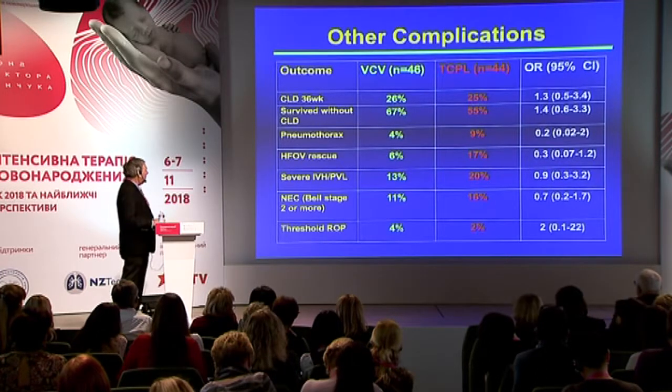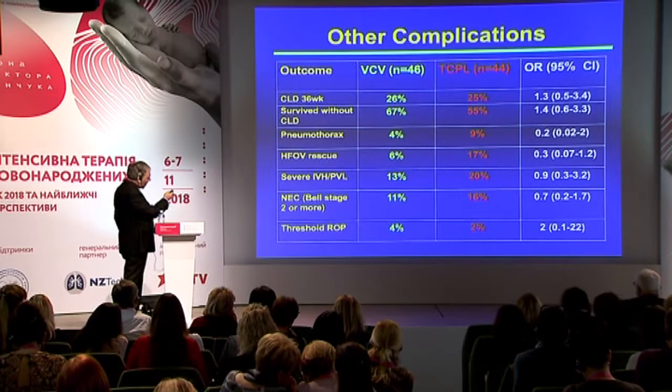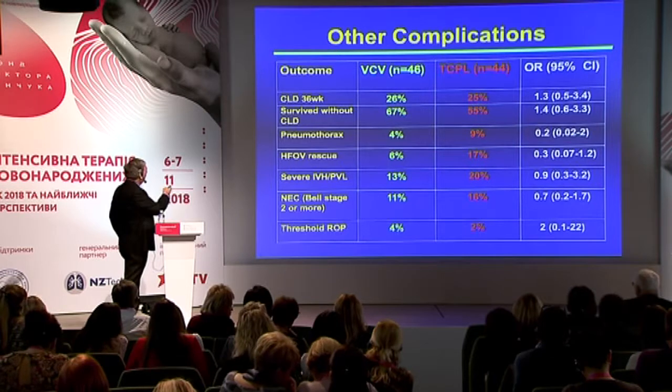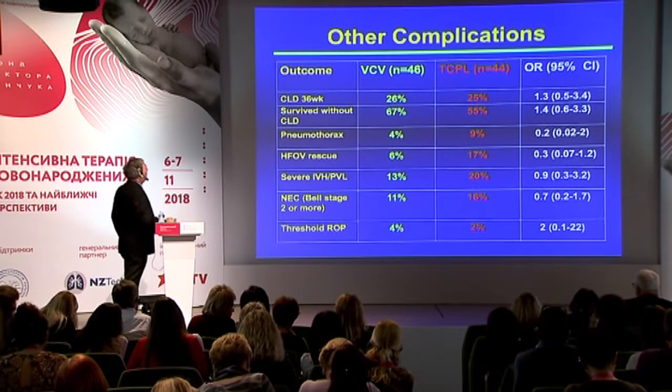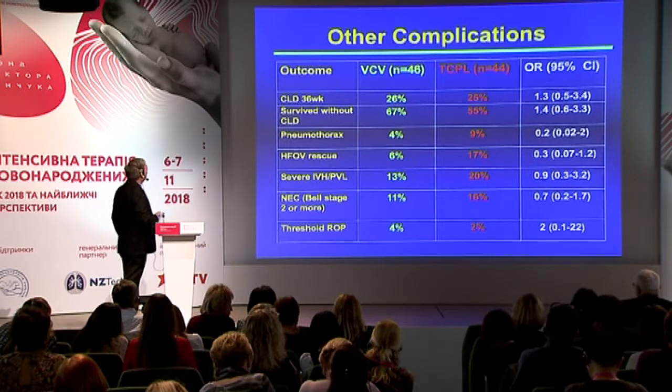Other complications were virtually the same. We didn't find a difference in this trial in chronic lung disease, but we think that a lot of this is the result of small sample sizes. Again, there are only 90 patients in the trial.